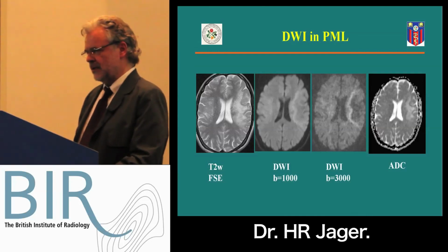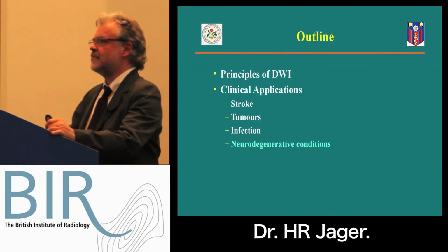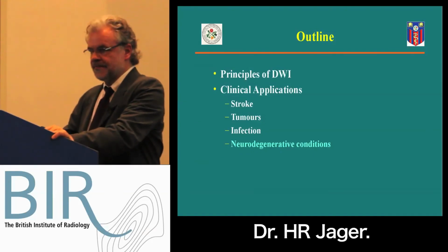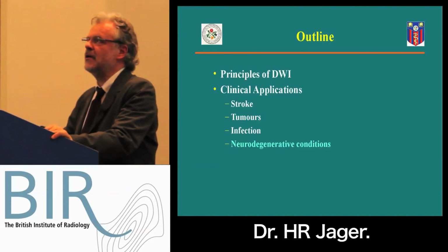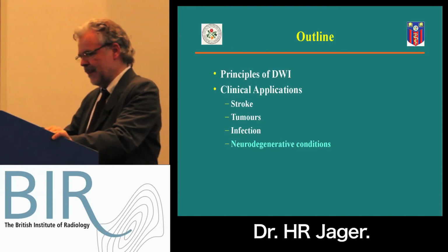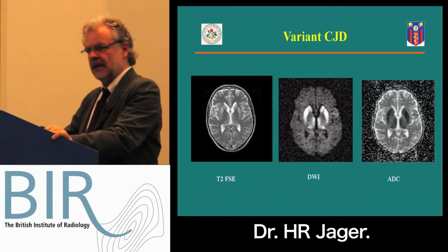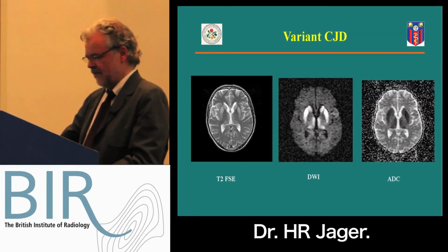Have you got 2 minutes for neurodegeneration? Yes? Okay. Now, you have a patient, and again, we will hear more this afternoon about dementia imaging, but one of the rapidly declining dementias is caused by sporadic CJD, and hopefully now first a case of variant CJD.